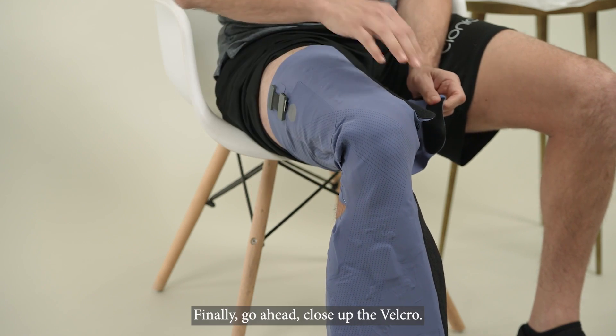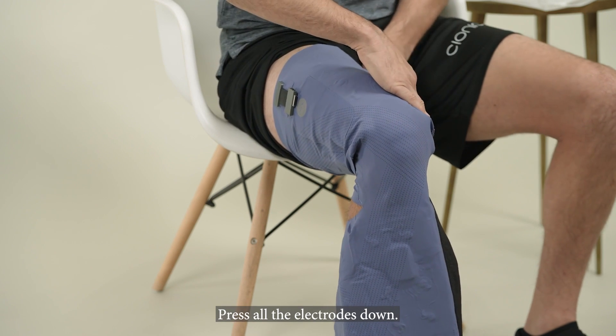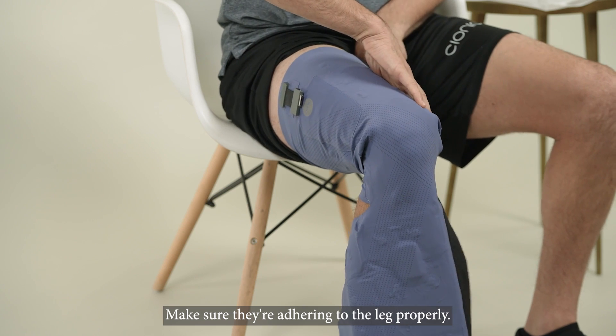Finally, close up the velcro and press all the electrodes down to make sure they're adhering to the leg properly.